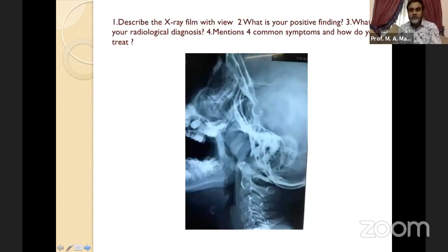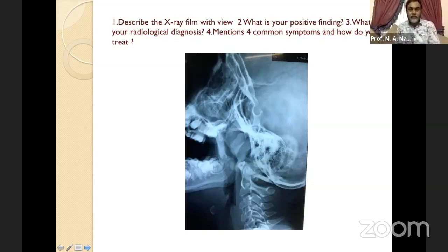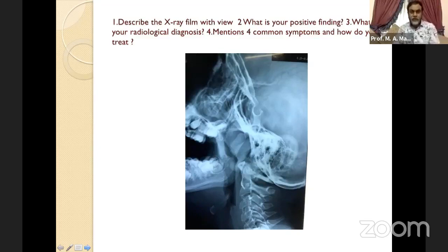This is one of the important X-rays for your exam. For any X-ray, usually four questions are asked: number one, describe or read the X-ray; number two, give your positive findings; number three, what is your diagnosis; and number four, how do you treat this patient. This systematic approach applies to any X-ray — describe it, state positive findings, give your radiological diagnosis, and explain the treatment.